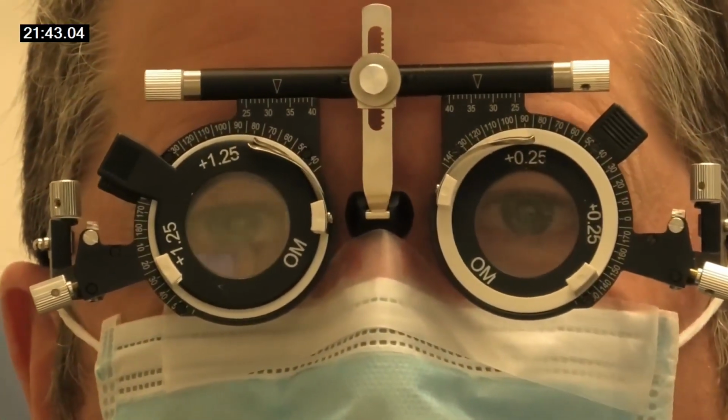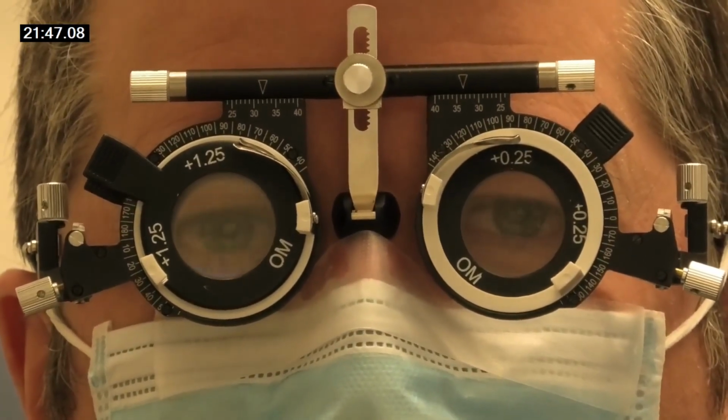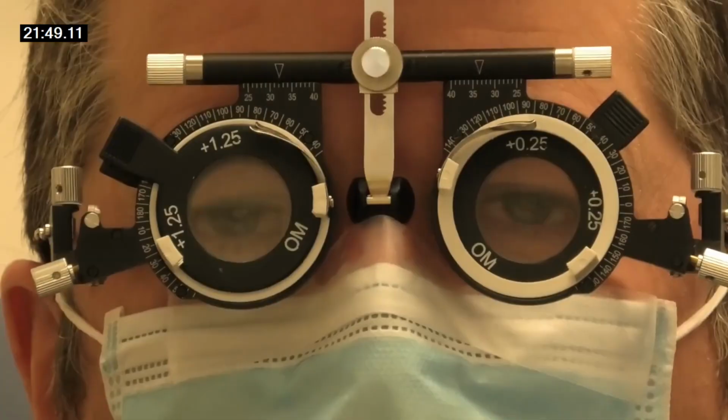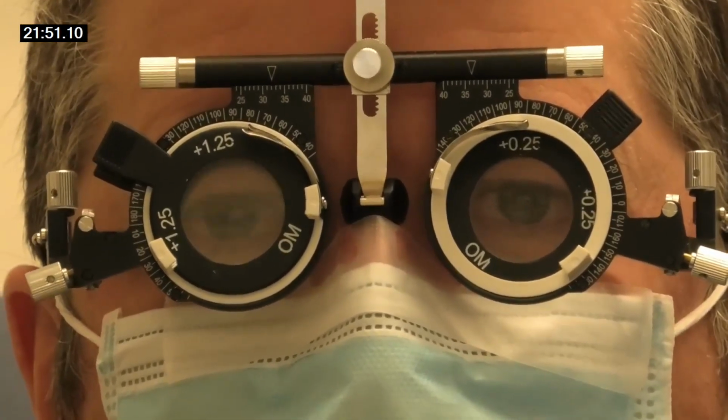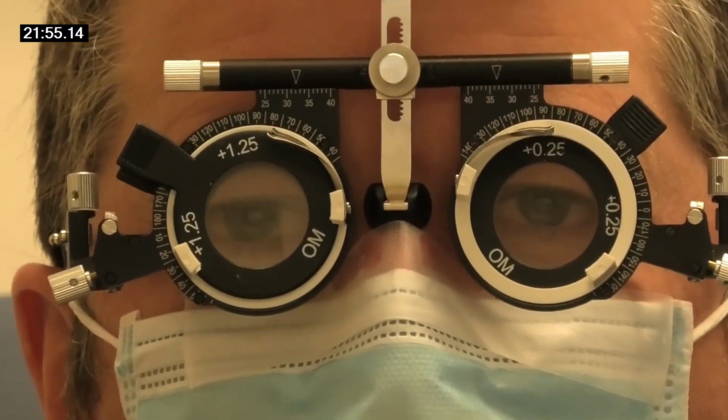Obviously, getting the patient to say yes a lot of times is actually a positive move in doing this eye testing. If they're agreeing with you, aren't they? Yeah. They think, oh, you're doing it. So let's see if there's any more plus on that. Okay.